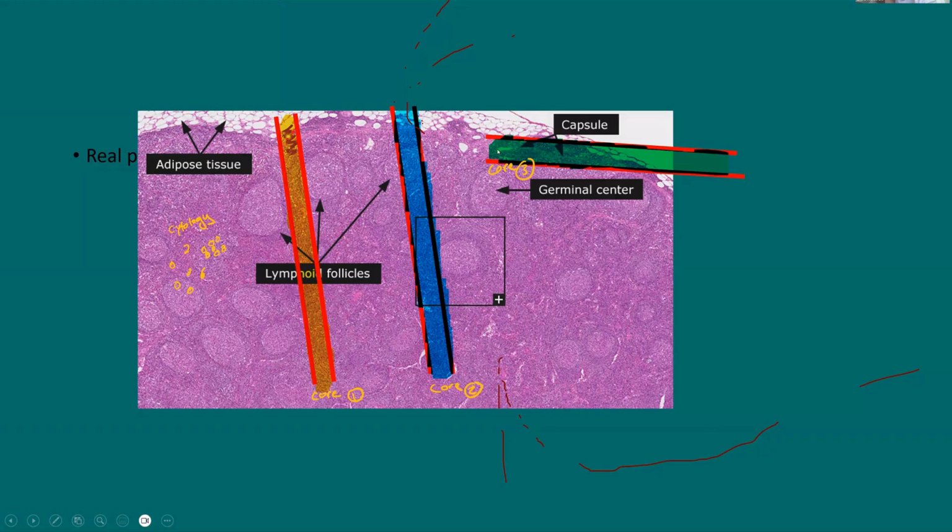Example number 3 is an inadequate core biopsy that goes through the capsule. So we aim to have one or two cores like core number 2, so we will gain a good assessment. This is the general map.